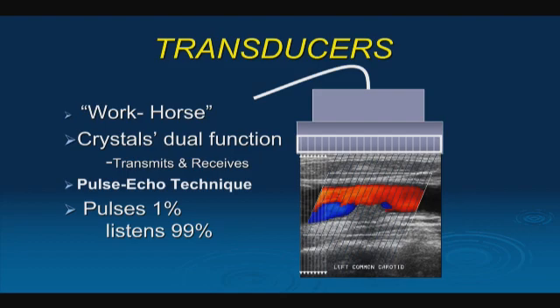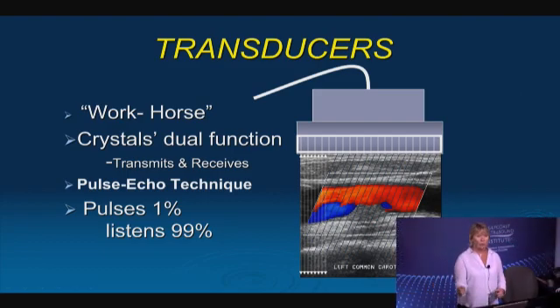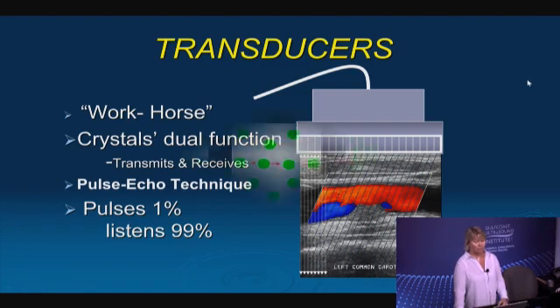It actually is listening for that signal to come back the majority of the time that it's sending and receiving the sound wave. And that allows us, when we scan, to scan in real time. So that when I move the transducer, everything moves with me rather than me moving the transducer quickly and the image moving in slow motion. You always want to be able to see the structure of interest as it truly is.